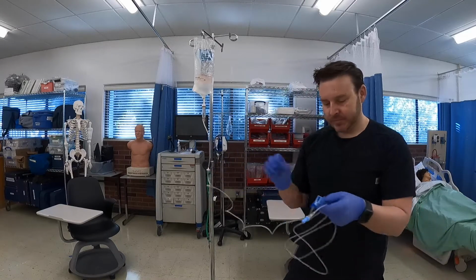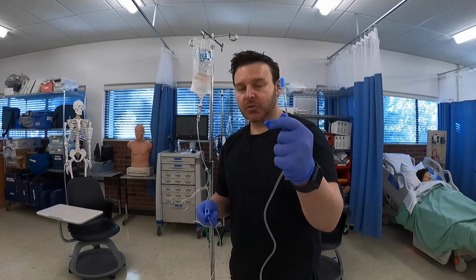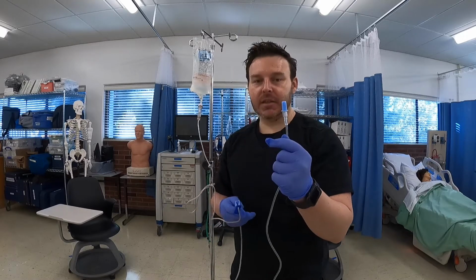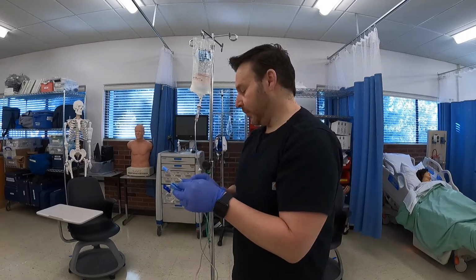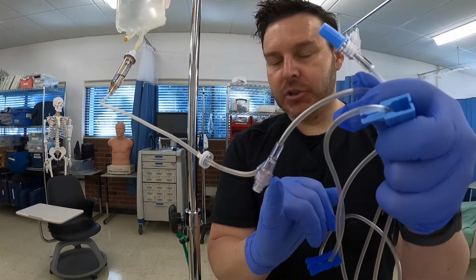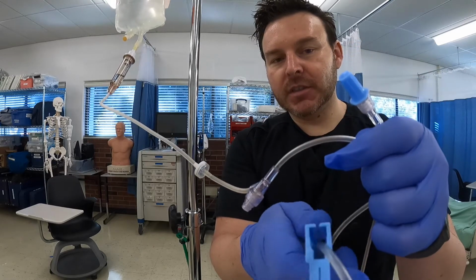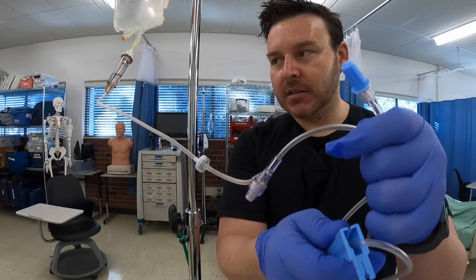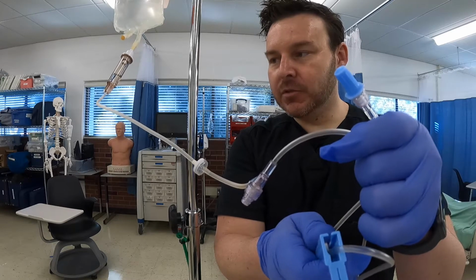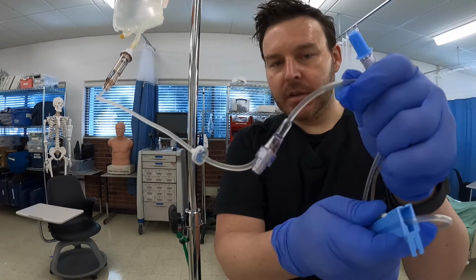So then I'm going to take control and make sure you have this in your hand to control it, because we don't want to be flinging this around and let it touch the ground and get contaminated. Okay, so now I just want to show you the port here. And so now I have my hand, and I'm going to release some of the pressure in that roller clamp, and the fluid is going to start draining in my IV tubing. Okay.